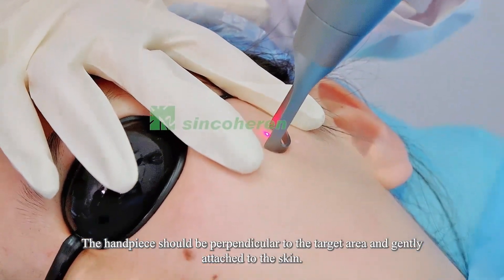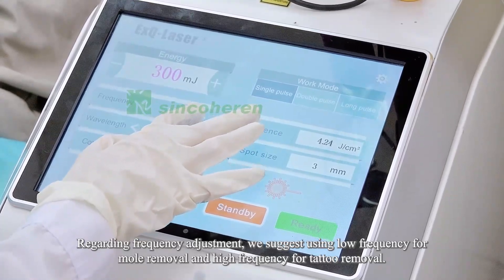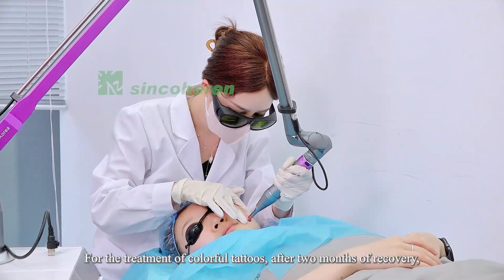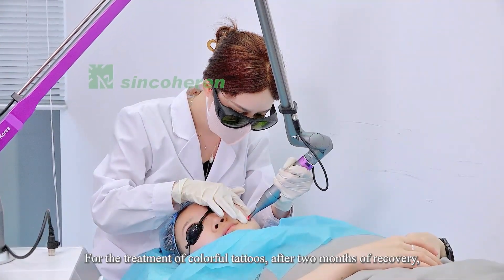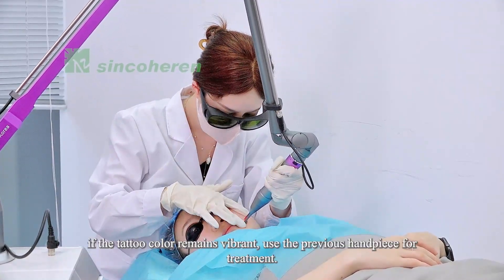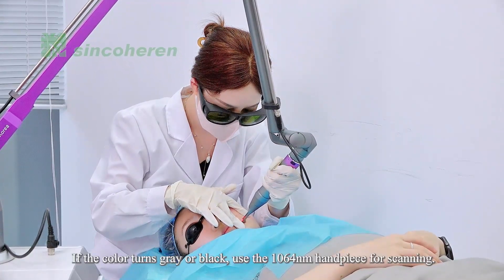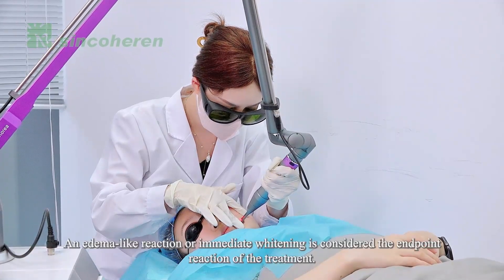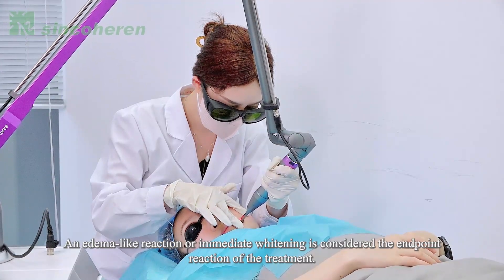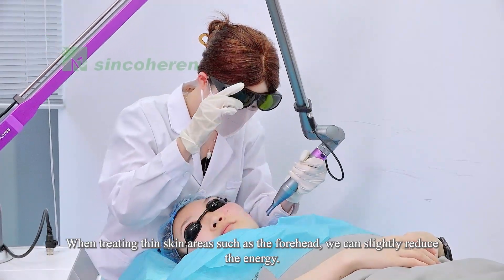The handpiece should be perpendicular to the target area and gently attached to the skin. Regarding frequency adjustment, we suggest using low frequency for mole removal and high frequency for tattoo removal. For colorful tattoos, after two months of recovery, if the tattoo color remains vibrant, use the previous handpiece; if the color turns gray or black, use the 1064 nm handpiece for scanning. An edema-like reaction or immediate whitening is considered the endpoint reaction of the treatment. When treating thin skin areas such as the forehead, we can slightly reduce the energy.